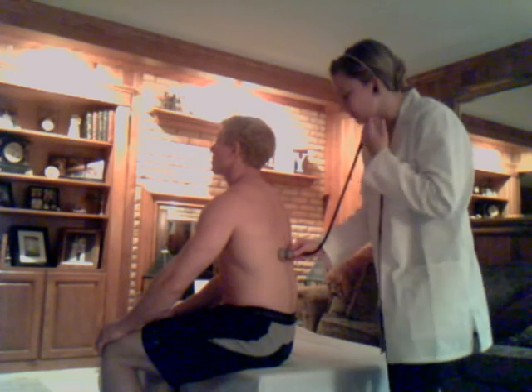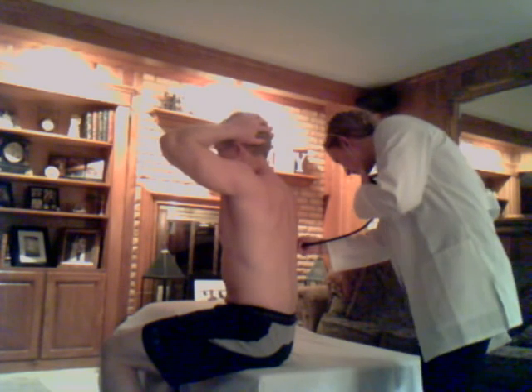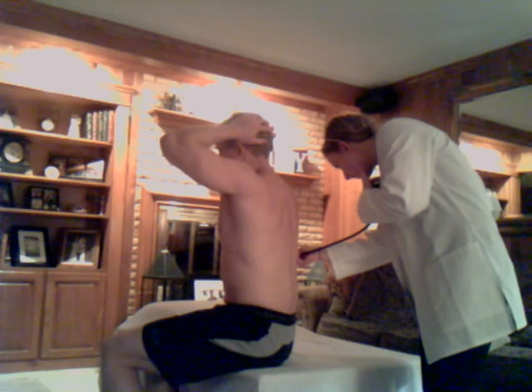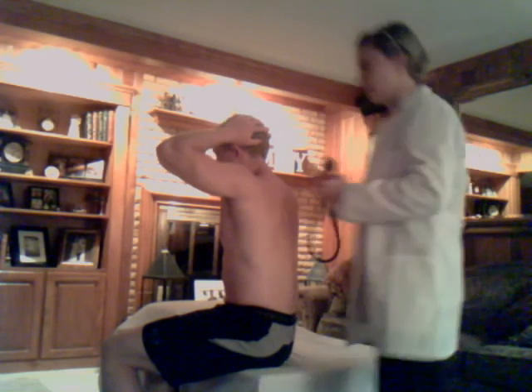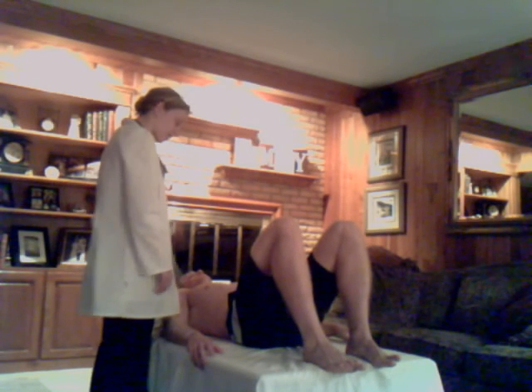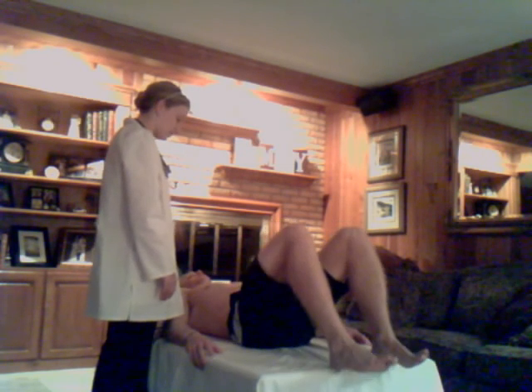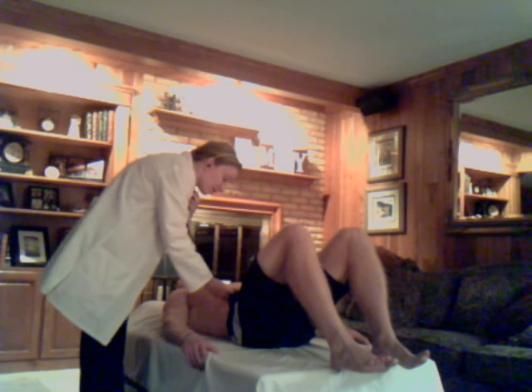Good. Can I have you raise your arms up so I can listen to your side? Okay, I will have you lay down. First, I will start by inspecting the abdomen, making sure that there are no obvious pulsations or movement. Then I will auscultate in all 4 quadrants. Sometimes you'll have to listen 2 to 5 minutes to hear any bowel sounds.